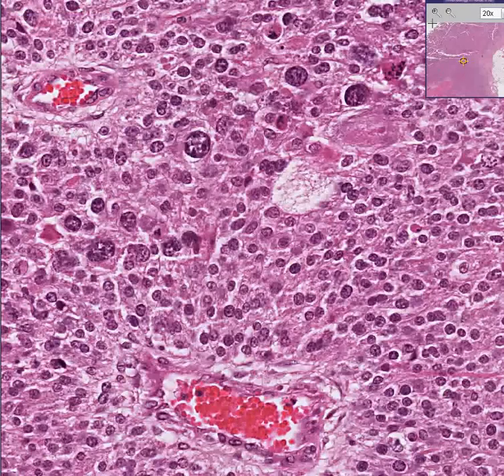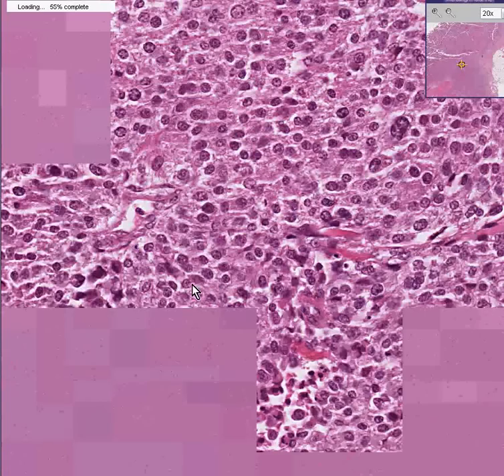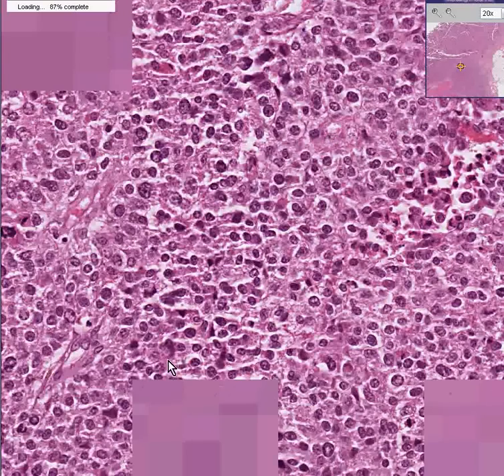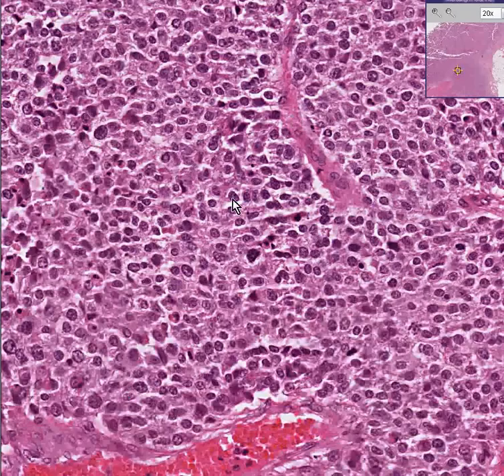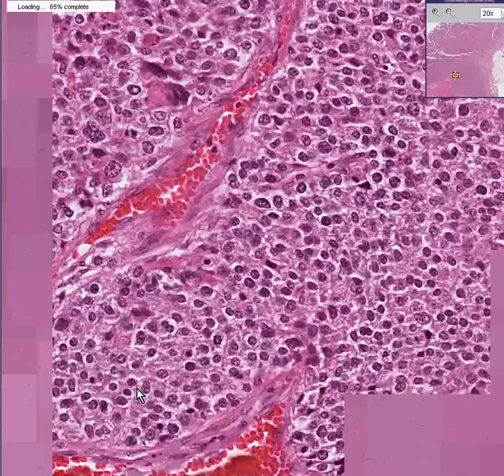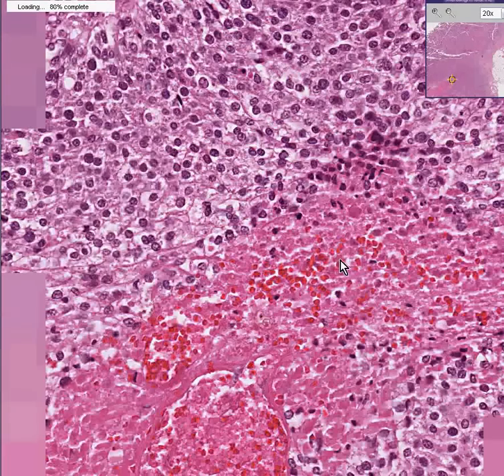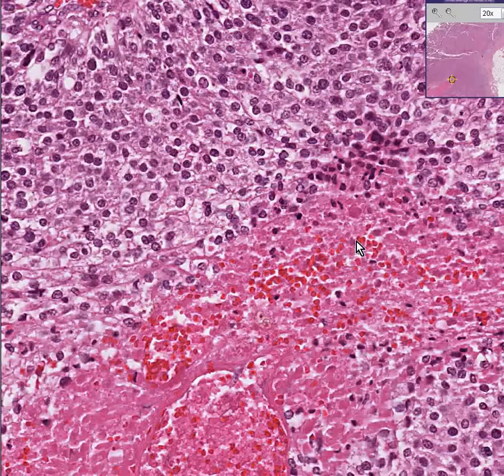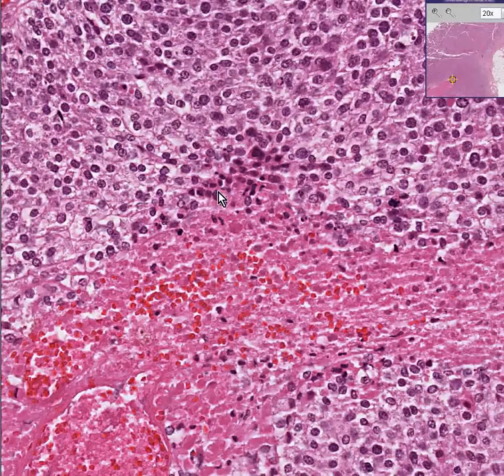Also, note in parts of the tumor, which we'll be going down to right now, that we'll have large areas as well as small areas in which you can see that the tumor is very largely necrotic as well, which malignant tumors are, because they tend to outgrow their blood supply, and then the tissue or even the tumor tissue becomes dead.